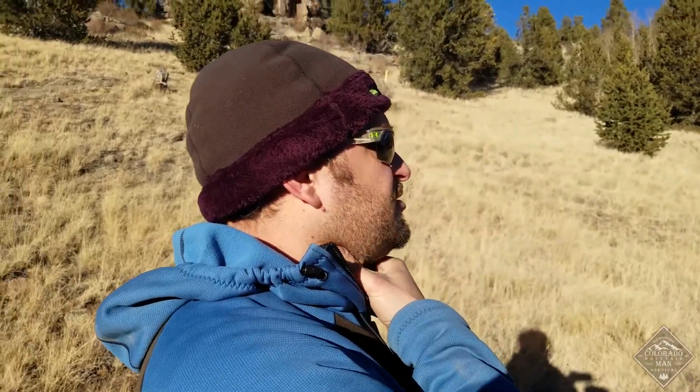One of the things that I recommend when you're approaching somebody is say, hey, do me a favor and don't move your head. Don't nod your head. Don't look at me. You can move your eyes, but try to keep your head still so they're not nodding yes and no.